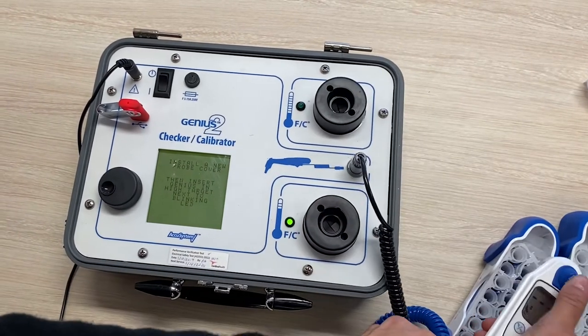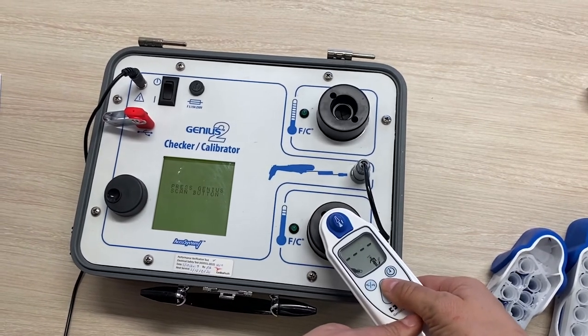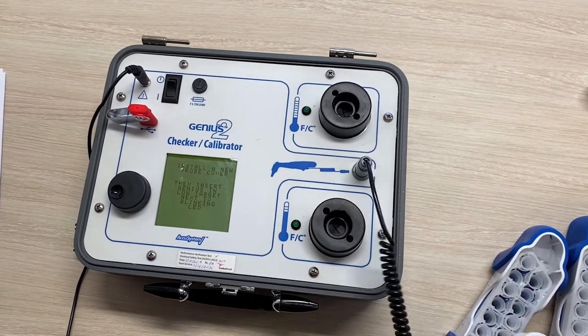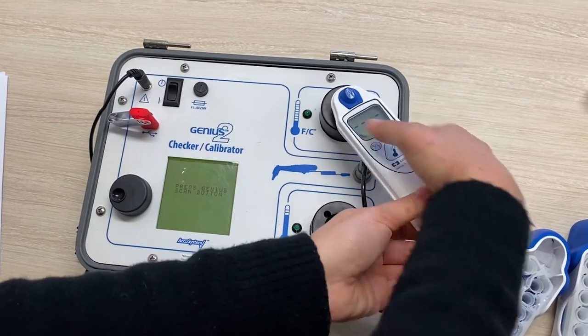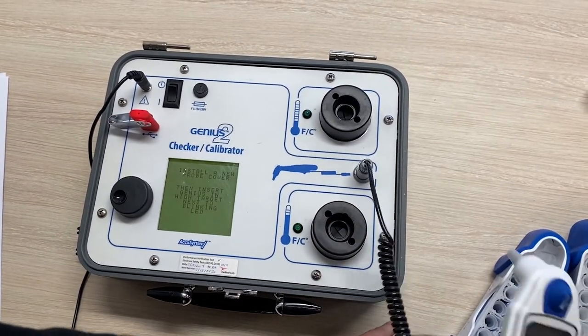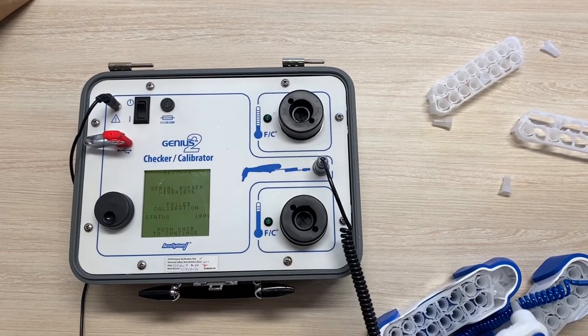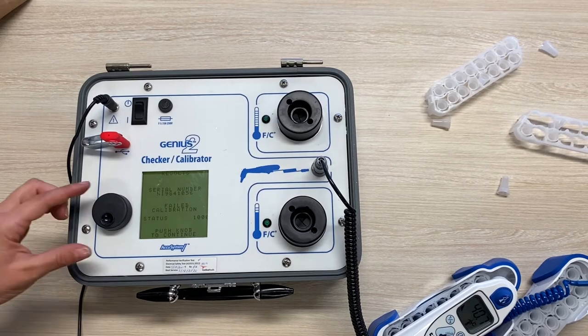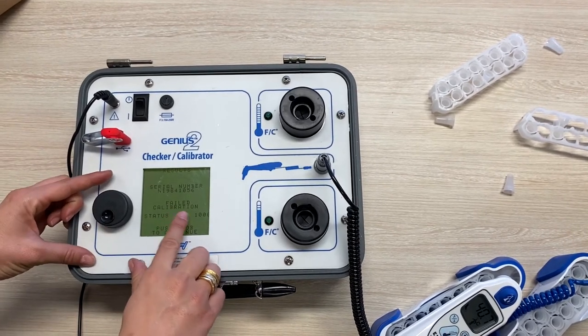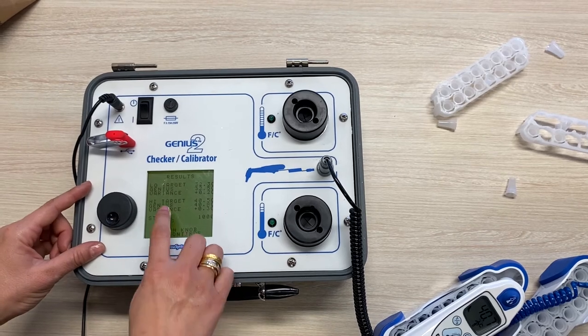We're going back and forth from low to high target, swapping probe covers in between each step. You really do need to concentrate here, because if you get distracted and accidentally place the thermometer in the wrong target, you will have to repeat all the steps over again. As you can see, we have failed calibration — the difference between the target and the thermometer is too great, so we have to repeat.